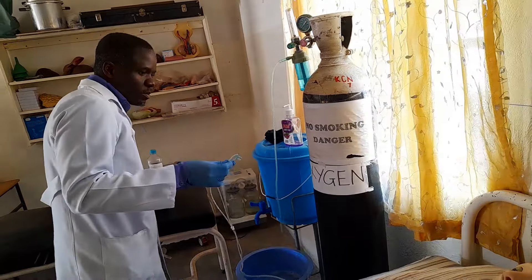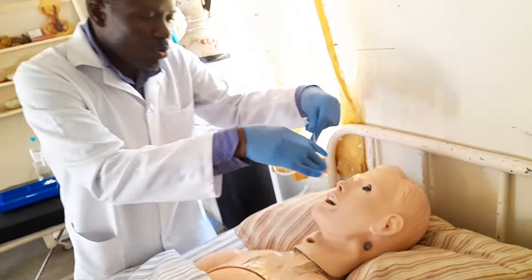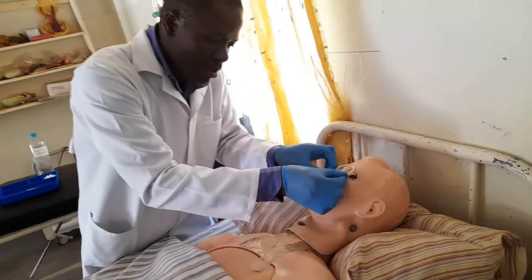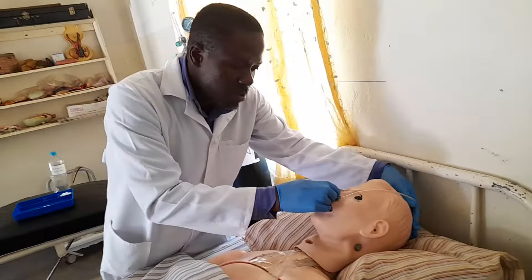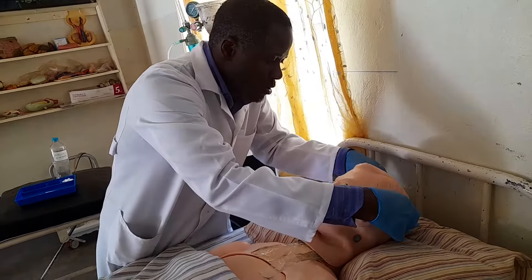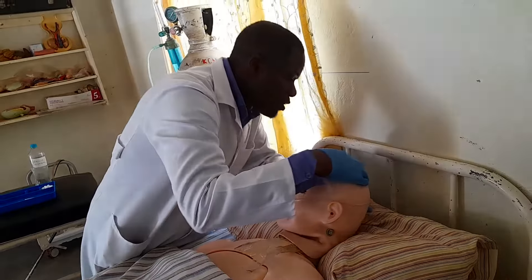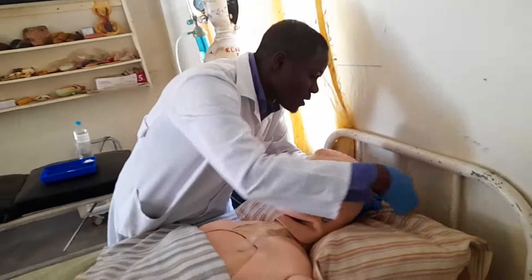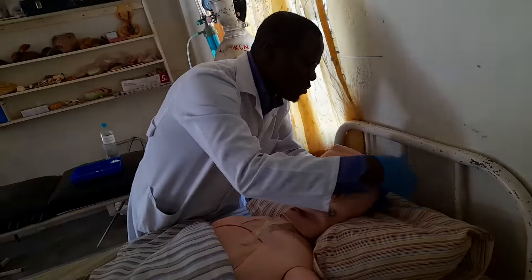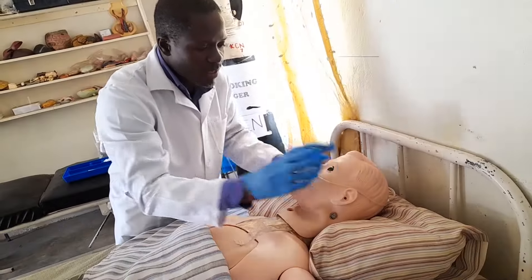Take the nasal prongs to the patient and place them in the nostrils. The tubing goes behind the patient's head. After that, make sure it is secure by pulling the stopper and tightening it.